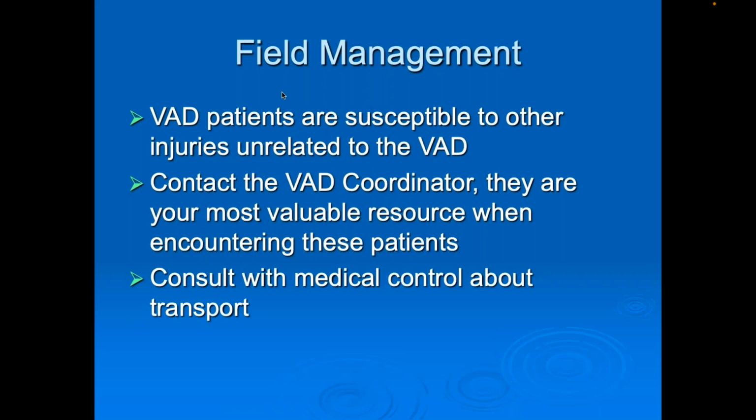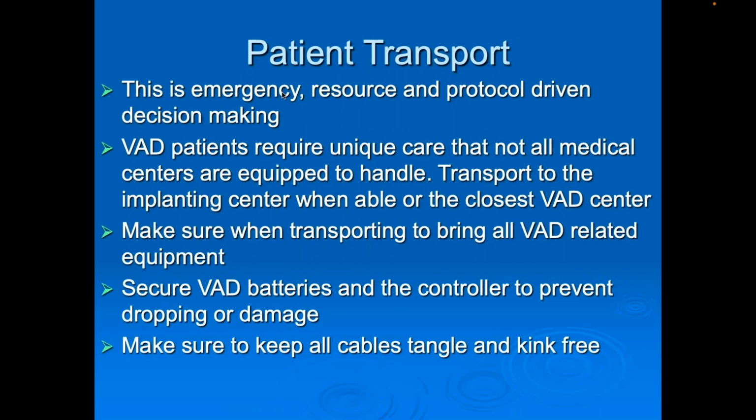VAD patients are susceptible to other injuries unrelated to the VAD. Contact the VAD coordinator. They are your most valuable resource when encountering these patients, and consult with medical control about transport. This is an emergency. Resources and protocol-driven decision making. Ventricular assist device patients require unique care that not all medical centers are equipped to handle. Transport to the implanting center when able to, or the closest VAD center.